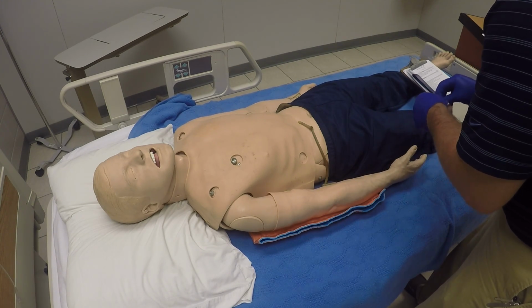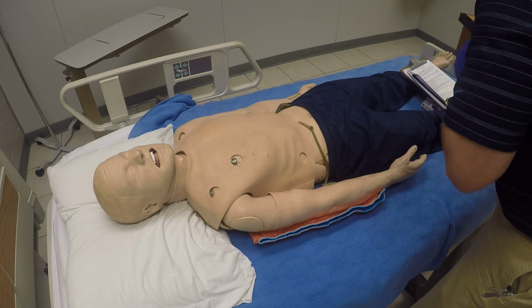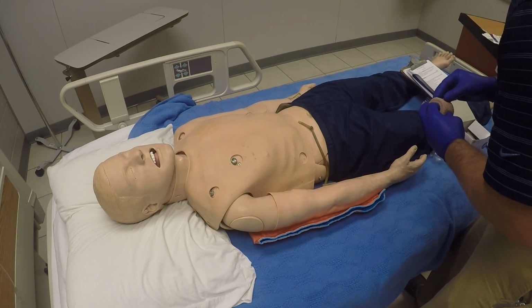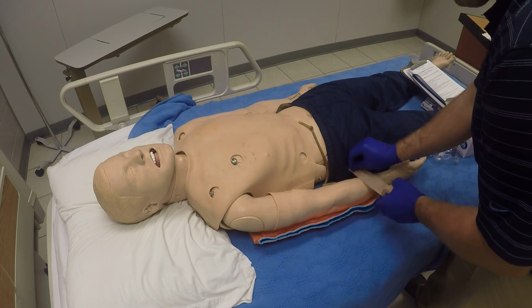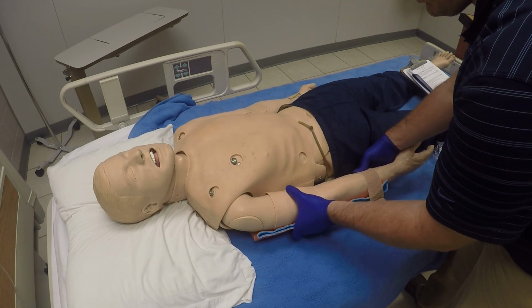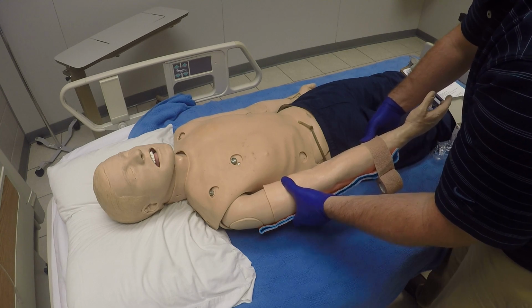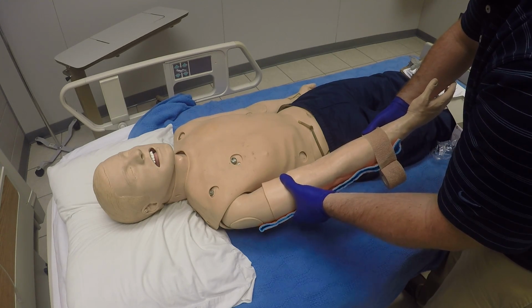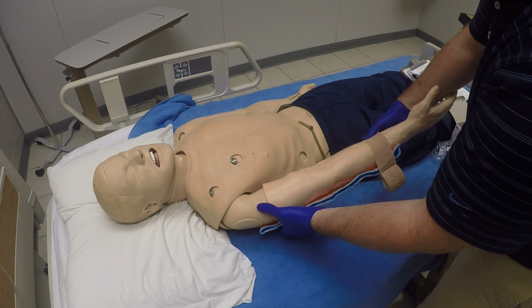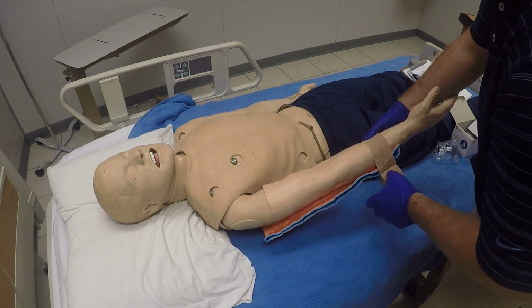We'll get this opened up, and we're going to go ahead and wrap it up real good with Coban, using that to immobilize it. You can also use roller gauze if you need to, and if you do need to manipulate the extremity at all, you're going to make sure you have a couple people here to help you, and make sure that you're not actually manipulating the injured site.